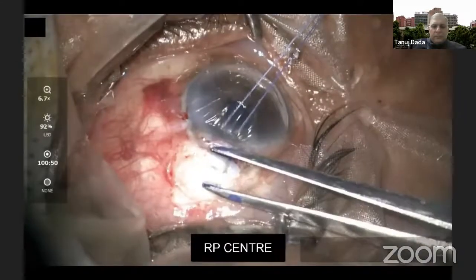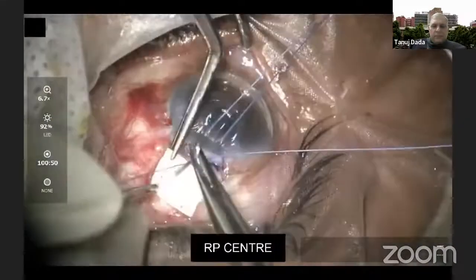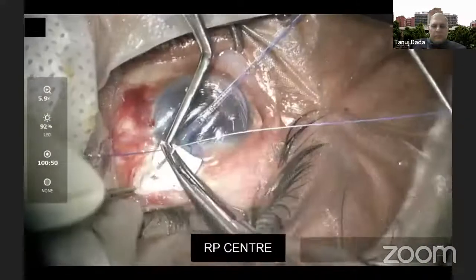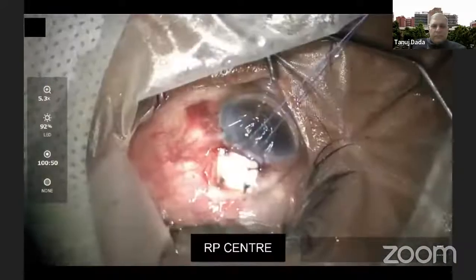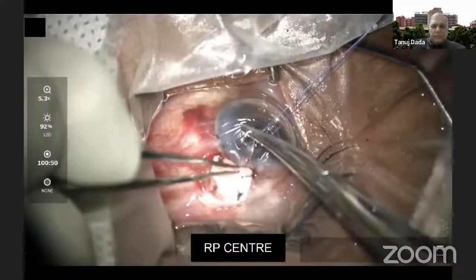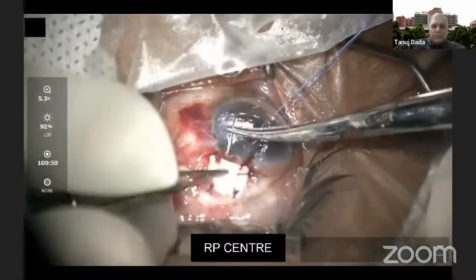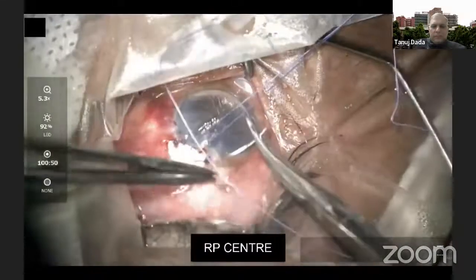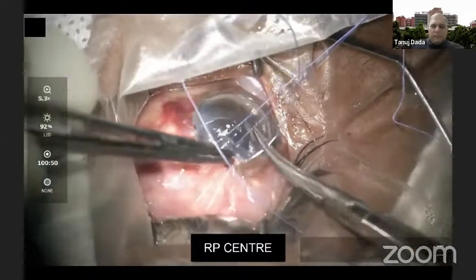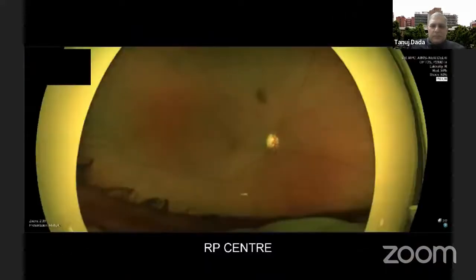After removing the necrosed scleral tissue, a partial thickness scleral allograft was fashioned and sutured at the trabeculectomy site using 6-0 Vicryl sutures at the 4 apices. Additional 10-0 nylon suture was used to fix the donor sclera anteriorly at the limbus. The conjunctival Tenon flap was then advanced over the scleral patch graft. Post-operatively, patient had good IOP control with resolution of hypotony maculopathy.